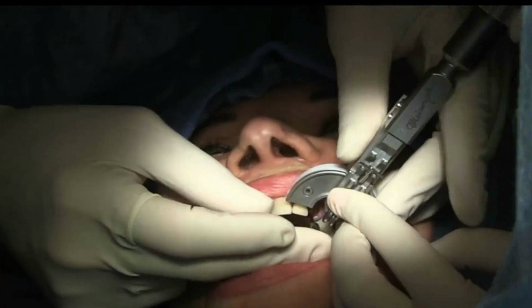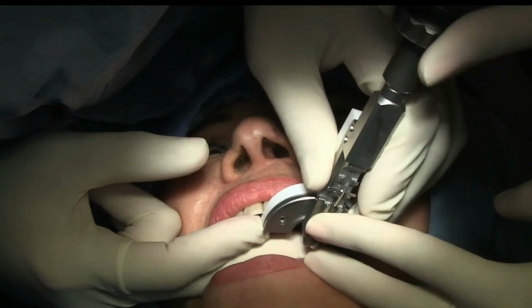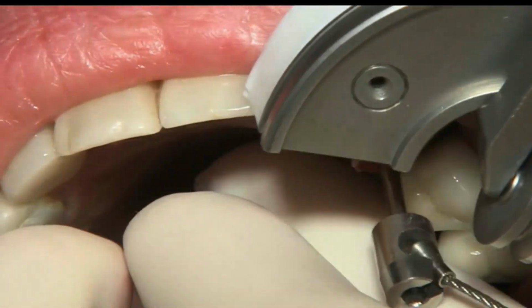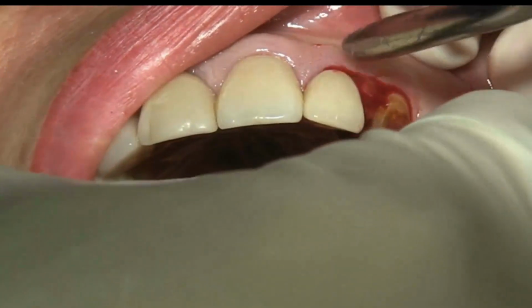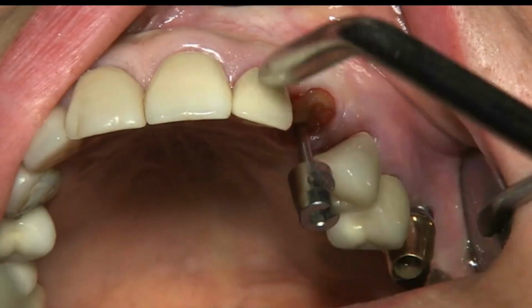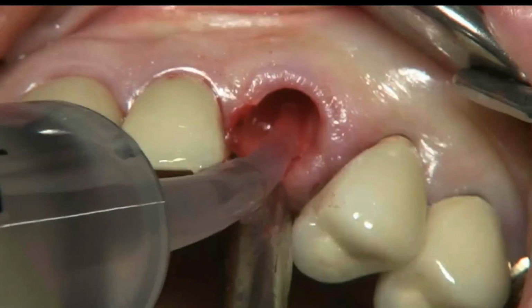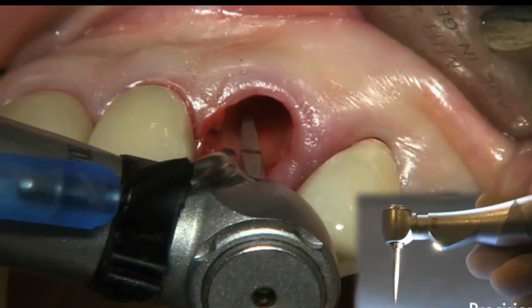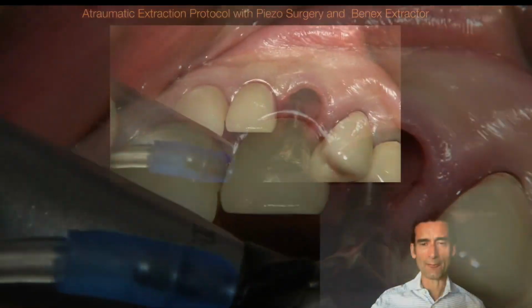It takes a little bit of time. You have to really place it on the teeth so it focuses well. And here you can see how the root comes out without damaging any of the bone. Beautiful. Look, that's great. Very, very nice. Straight out. And now, of course, you have buccal bone. You have all the bone. Now you're cleaning it, so you have enough blood supply. Then you could even activate a little bit by the drill, so you can have enough bleeding for the next step, which is the socket.